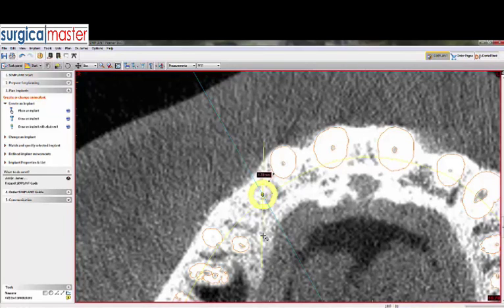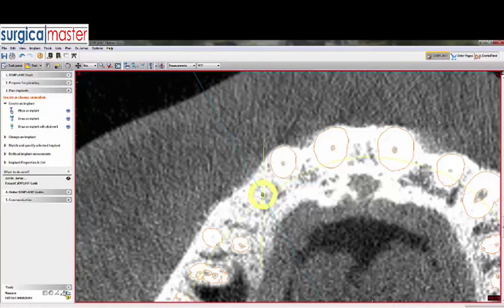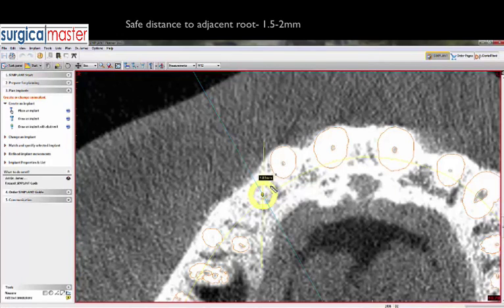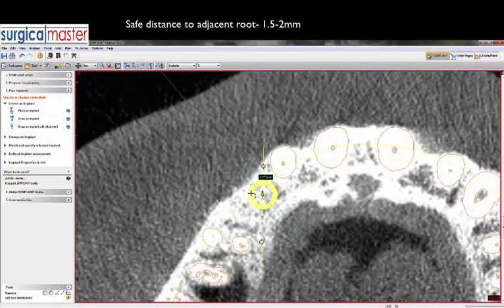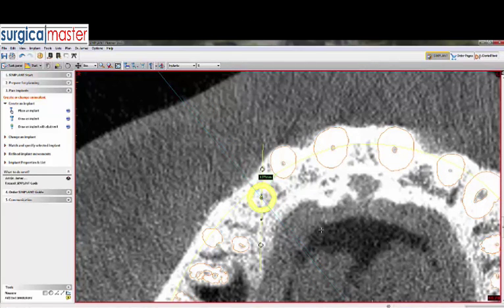We'd like to be between 1.5 and 2 millimeters. I'm going to make a measurement of about 1.8 millimeters — that's reasonable. Now I'm going to take the implant and move it distally, bodily, in the axial view. We're now at the safe distance.